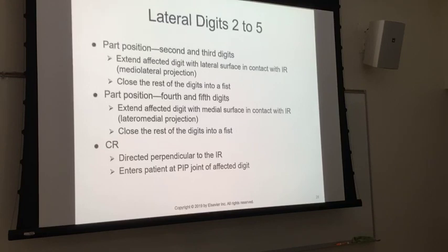Okay, so bend all the other fingers out of the way. You got number 4, or you got number 5. Number 4 presents a bit of a challenge. The textbook says bend all your other fingers and extend number 4. Can you do that very well? I can't. What I can do better is extend all the other fingers and bend that one, if at all possible. If the patient can't bend the finger, what you can do is bend these two and do that, okay? So that is better than this, right? You got a lot of superimposition there as opposed to a little bit there, okay?